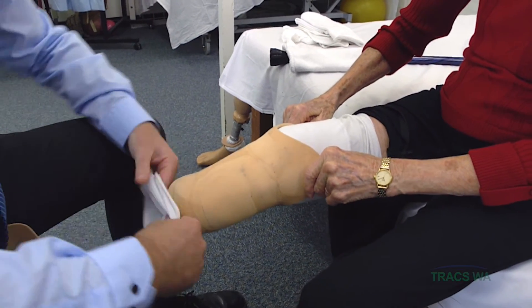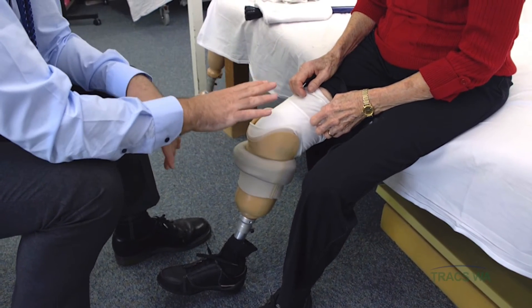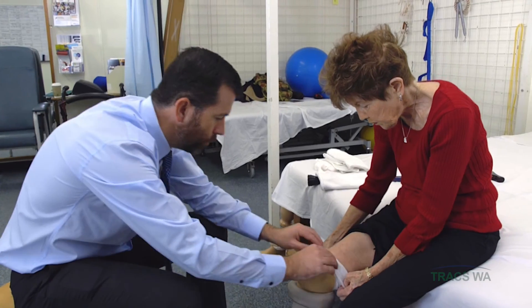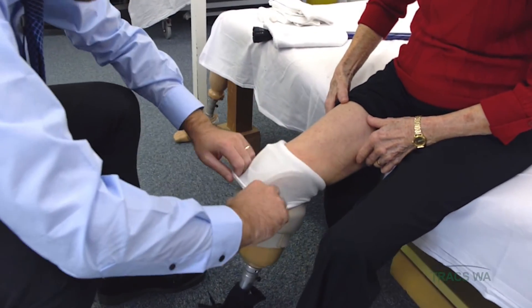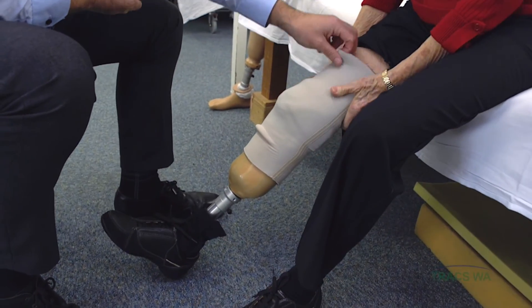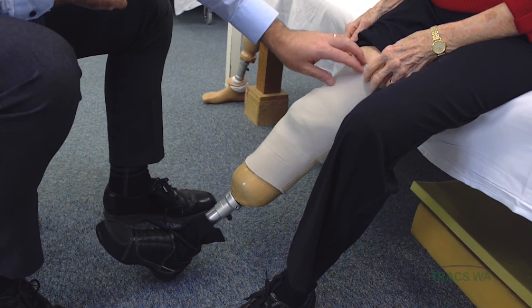We then fold this back over as we had done before. At this point, we need a little bit of downward pressure from your leg to stop your leg from coming out. We don't want you to pick the prosthesis up — just a little bit of downward pressure through the prosthesis while you pull the sleeve up. The best way to do that is to bring it back over the top of the socket, but we don't want to pull it right down. Just fold it up and then roll that sleeve up. We want three or four inches of the sleeve on your skin, matched by three or four inches of the sleeve on the socket — that ensures a good grip and a good airtight seal.